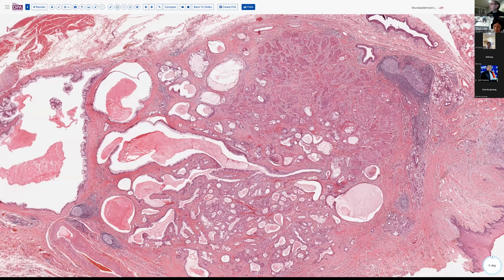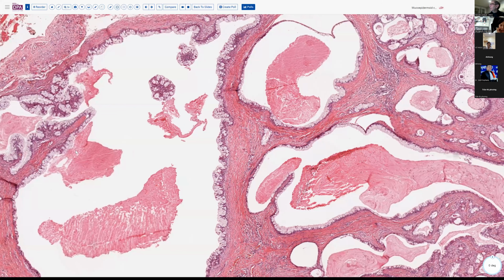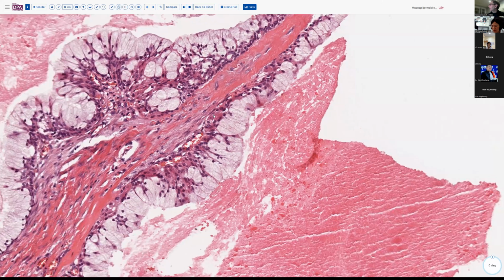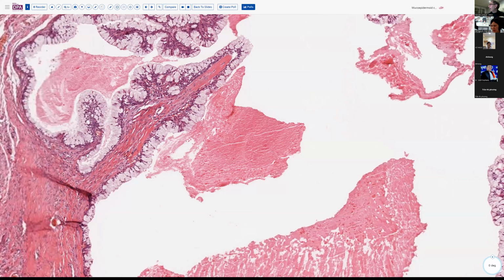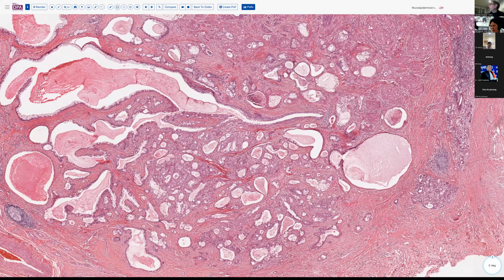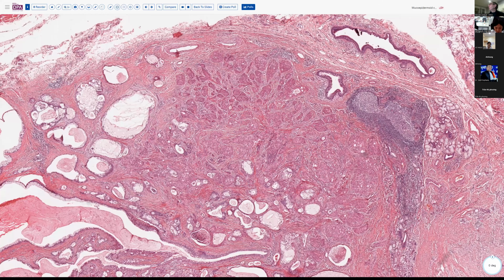And it may have started with this mucocele type of appearance here, a low-grade mucoid metaplasia, if you will, with more basal type nuclei in these cells, but then has clearly developed into an invasive pattern with this infiltrative pattern of both this glandular element here and the squamoid elements up here. So kind of a nice insight into the pathogenesis and development of this tumor.